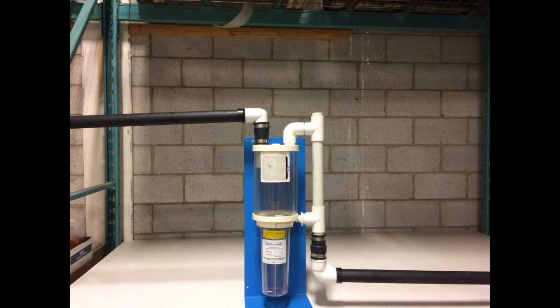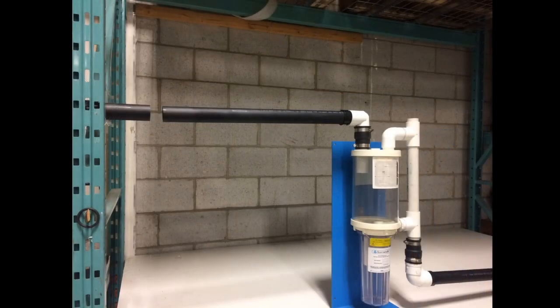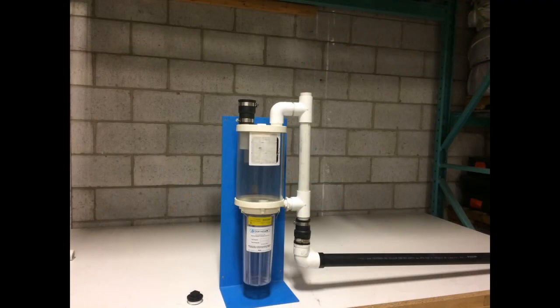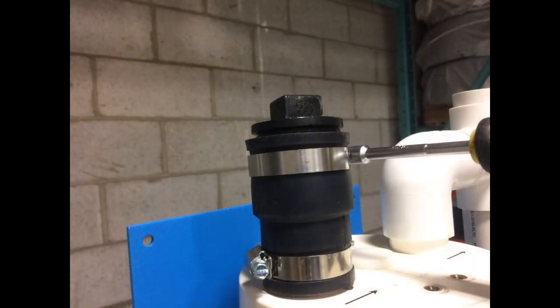We begin the upgrade to a Liberty Boss by removing the old amalgam separator. If your old amalgam separator has been hard piped in, cut the inlet pipe a few inches from where it enters the mechanical room, leaving roughly 3 inches of pipe from the chair inlet. Turn on your suction pump to drain any excess water. Use your 5/16th nut driver to loosen the hose clamp on the rubber coupler attached to the old amalgam separator inlet. Lift the pipe out of the amalgam separator inlet. Place the supplied closeout plug on the inlet of the old amalgam separator.